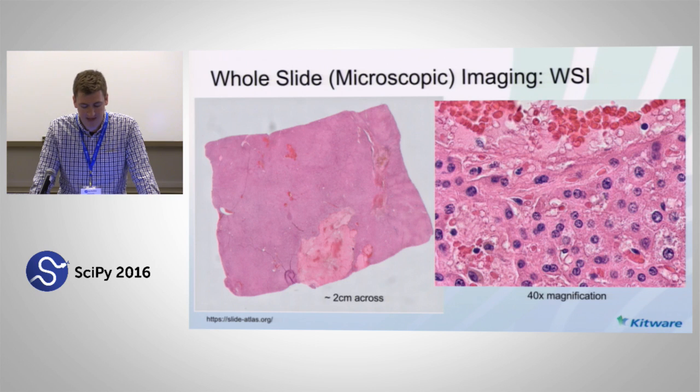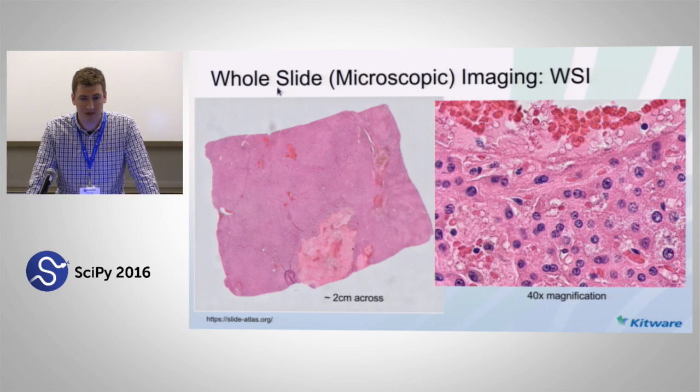Just to show you, here is a fully zoomed out tissue block, and then you can get to this level of detail where you're making out individual nuclei. You can tell which ones are undergoing mitosis, and you can see a lot of really interesting structures. Right now it primarily deals with bright field microscopy. We do a little bit of fluorescence and immunohistochemistry, but it's not anything too exotic quite yet in what we're working on, but it certainly applies to any modality that involves imaging very large surfaces.